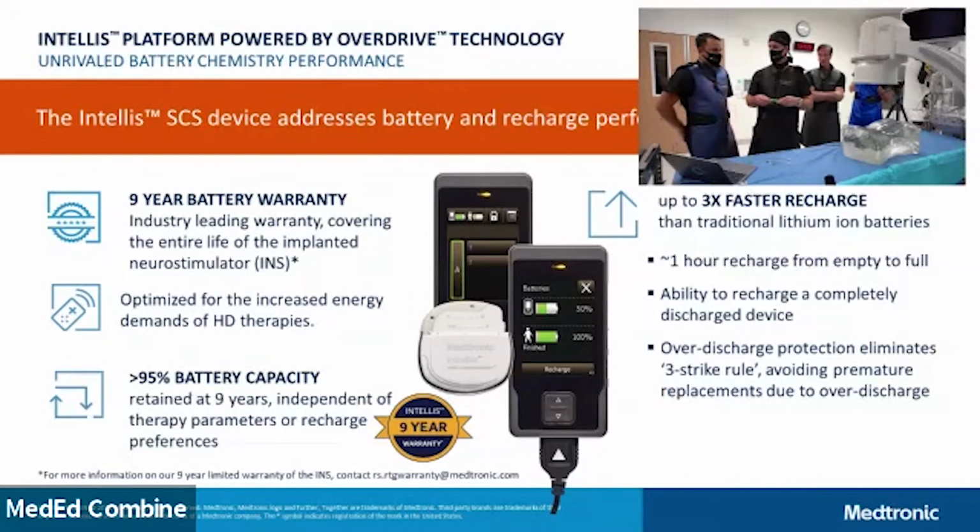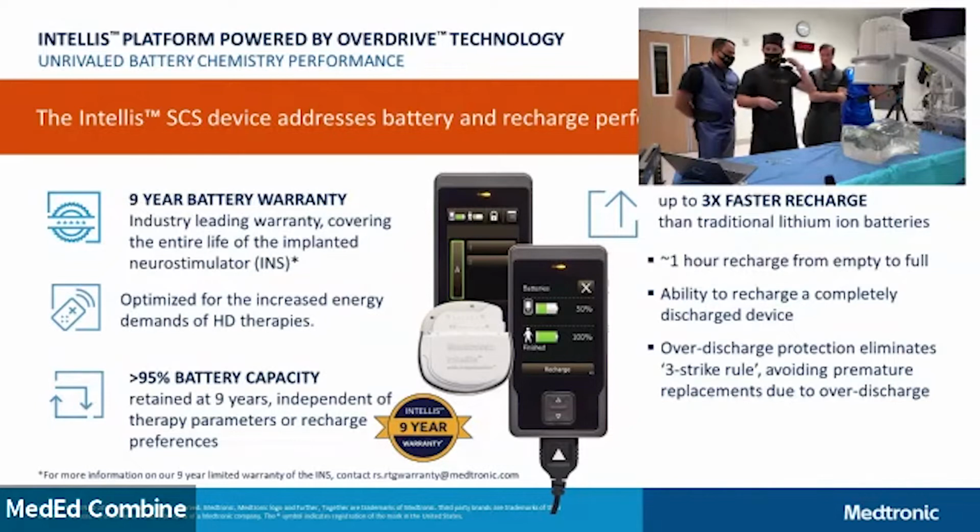I'm glad you mentioned that, because the majority of infections we get when we do this is the battery pocket. Yeah. And you might think, oh, we're putting a lead in their epidural space. That's really scary. No, it's the battery pocket. There's a foreign titanium device in there. And I'm telling you that you have to really do a clean surgical procedure to keep those in there safely. Exactly. We've all had to remove one for some reason or another.